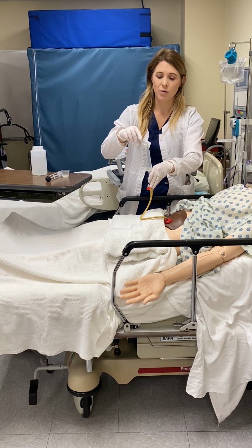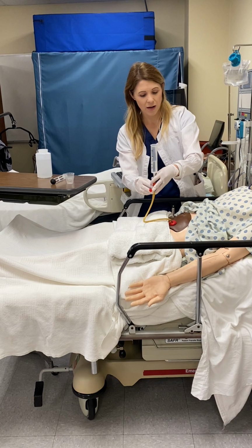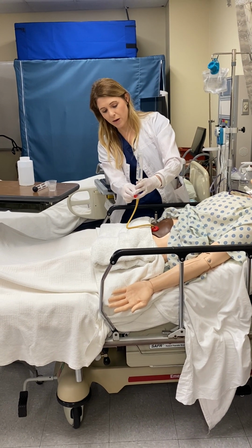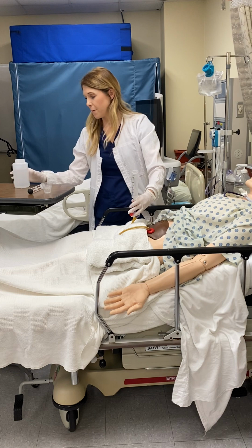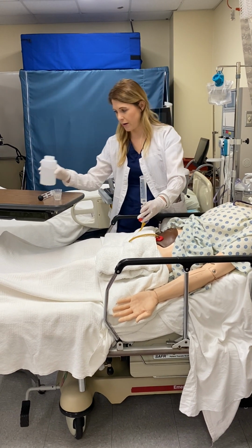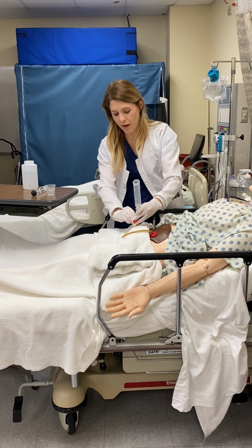And now I'm gonna give you your multivitamin. That's your first medication. And this is just to replenish any vitamin lost and maybe to help with some wound healing. And so now I'm gonna open it back up and give you that medication, coming down with gravity, and I can use my stopcock. Now I gotta flush a little bit between meds. Let's do about 10 to 15 mLs. Open my stopcock, raise it up, come down with gravity.